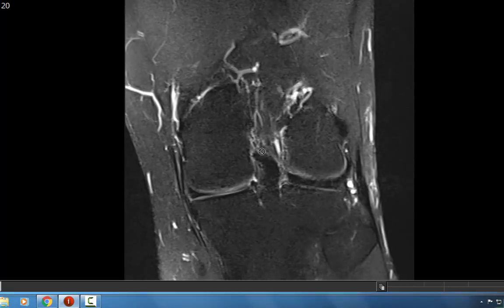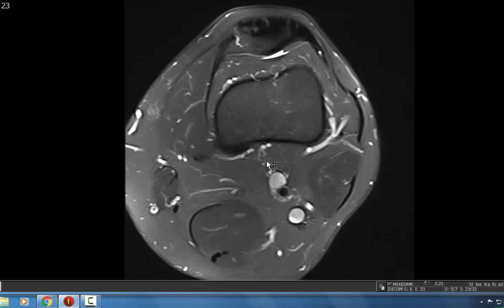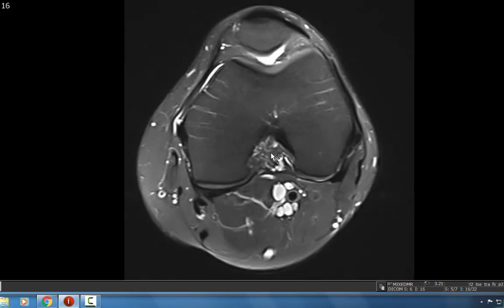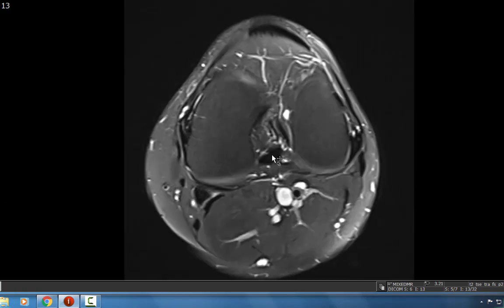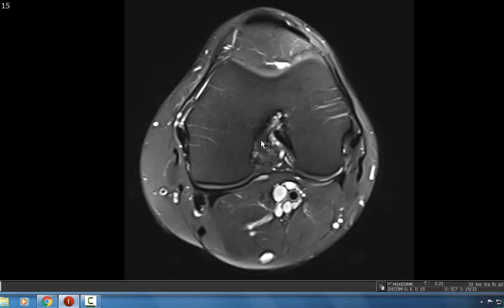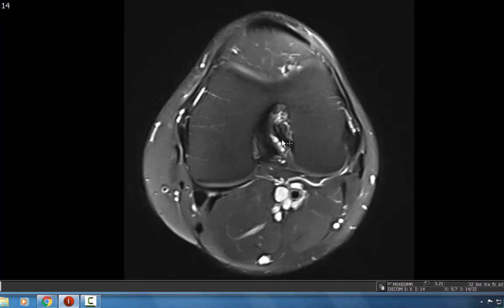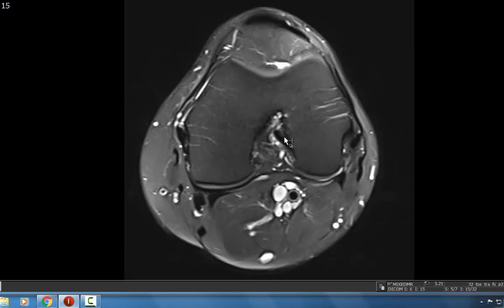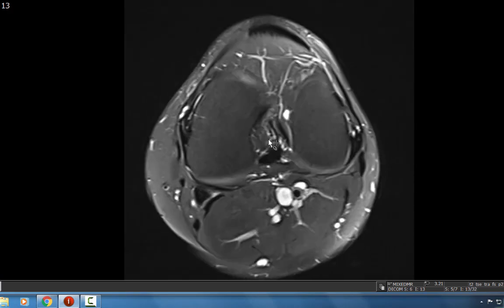You can assess the cruciate ligaments on an axial image as well. Here we can see the PCL and the ACL as distinct structures, confirming their integrity on multiple planes.